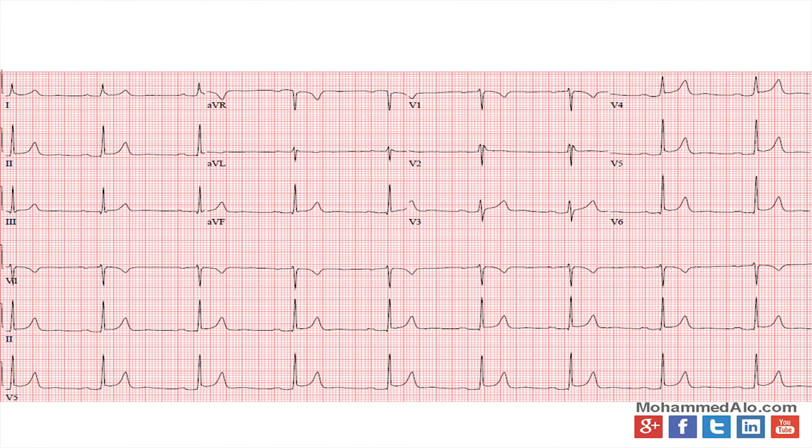Lead 2 does show some ST elevation. There's no reciprocal changes. It's probably another case of benign early repol. Patient seems somewhat bradycardic. I didn't count it up. You can do that, but this is basically another early repol with what appears to be a prolonged first degree AV block, or prolonged PR interval.